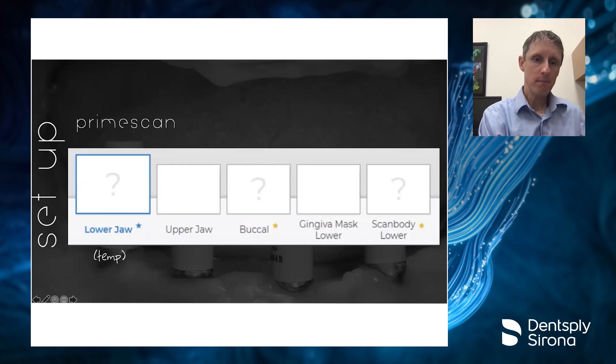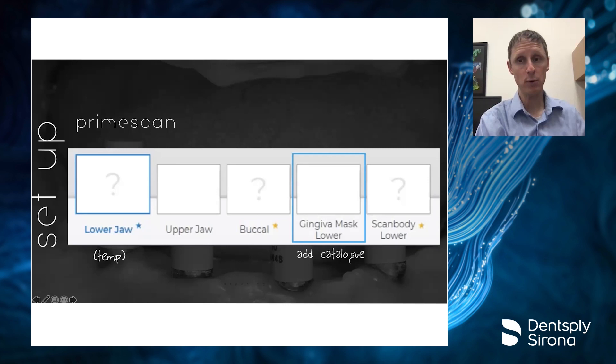If you're using the Prime Scan, this is how you set it up in the software to work with your lab and send to Atlantis. One nuance: your treatment arch is where you actually scan your temporary prosthesis — you're not doing a biocopy — because otherwise your bites won't line up correctly. You also need to add the catalog for gingival mask lower. Under scan bodies in the Connect software, find the multi-unit abutment option for smart fix abutments, and that will set everything up except that gingival mask catalog.